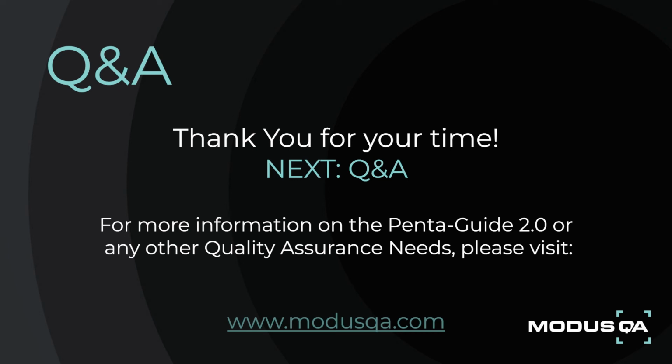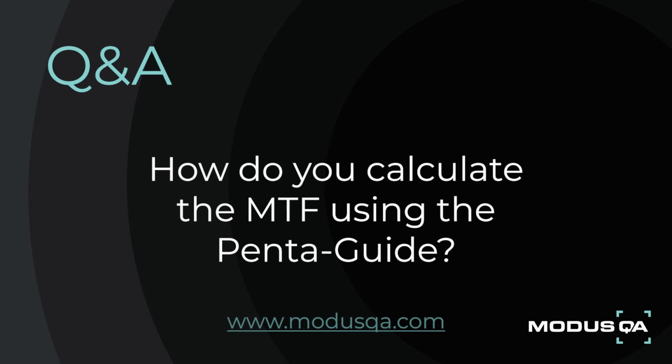So, first of all, how do you calculate the MTF using the Penta-Guide? We use a CATPHAN for this. Yes, this is a complex one. I'll get into a bit of a physics discussion here.